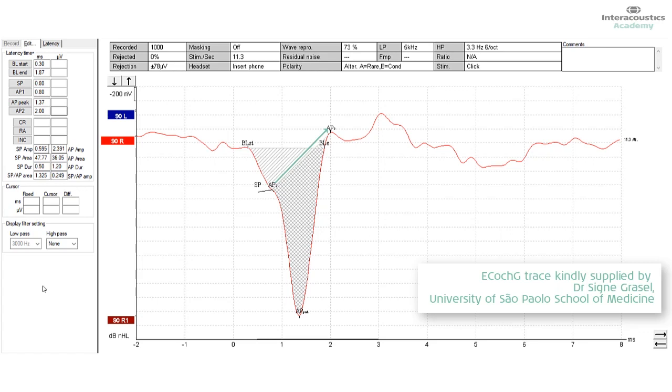And the Interacoustics Eclipse Evoked Potential Unit makes it very easy to do that. This then represents the combined markings that show both the AP amplitude and area, as well as the SP amplitude and area.